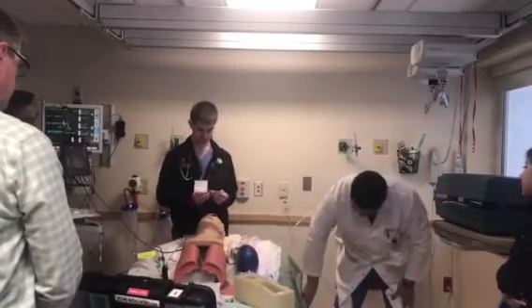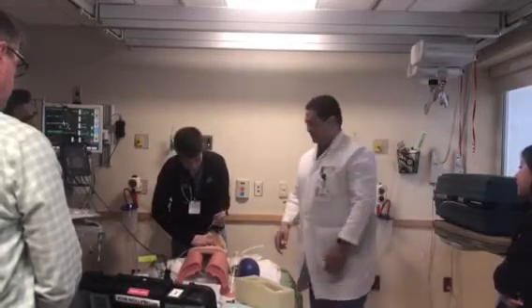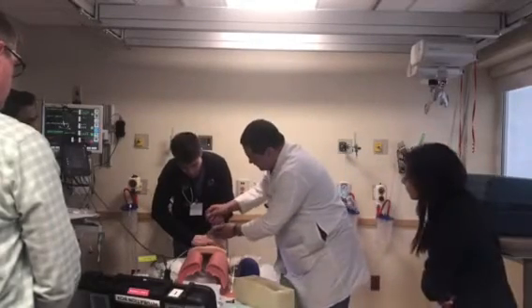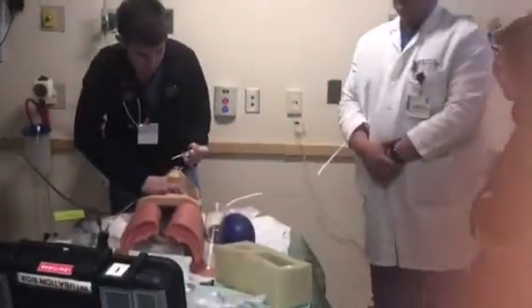So here it is. I'm not gonna puncture the mannequin because we don't have mannequins in this hospital that can be done a cric, right? So we're gonna do 60 degrees angle like this. Mistake. There's a mistake. What did you do?